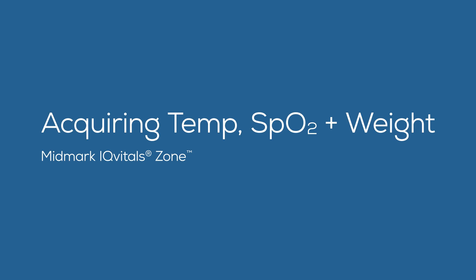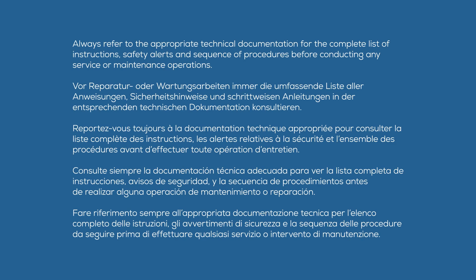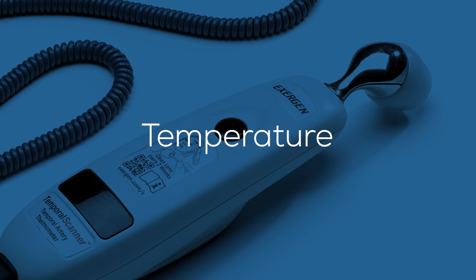This video is an overview of how to initiate temperature, SpO2, and weight measurements using the Midmark IQvitals Zone vital signs device. Always refer to the appropriate technical documentation for the complete list of instructions, safety alerts, and sequence of procedures before conducting any service or maintenance operations.